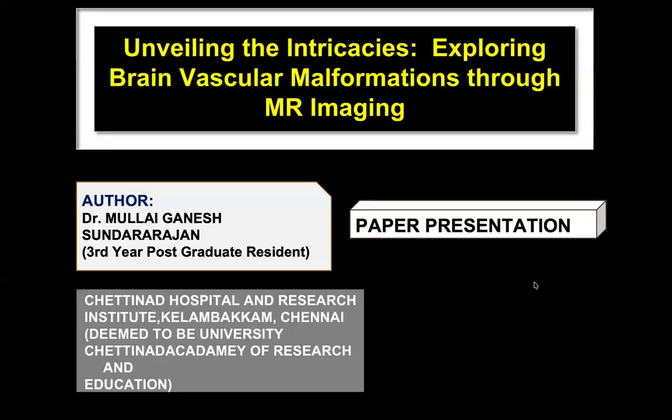Good morning, myself Dr. Mullai Ganesh from Chettinad Hospital and Research Institute, Kelambakkam. Today we are going to see the topic: Unveiling the Intricacies, Exploring Brain Vascular Malformations through MR Imaging.